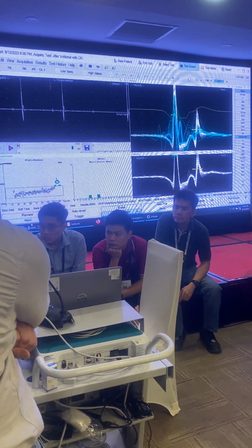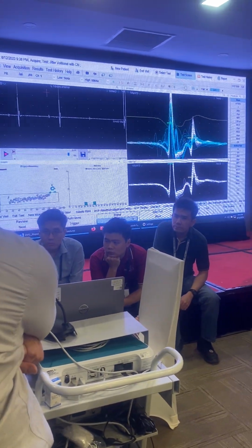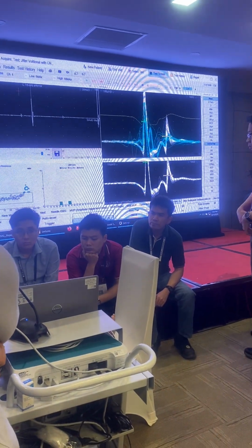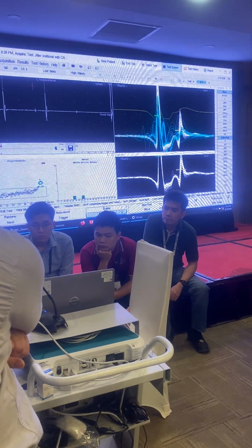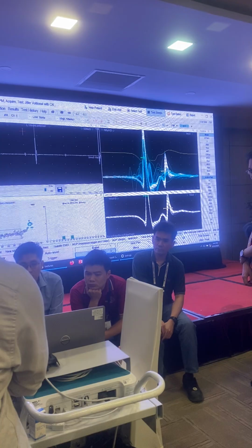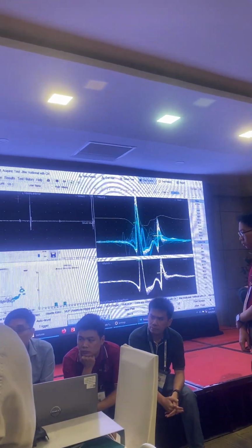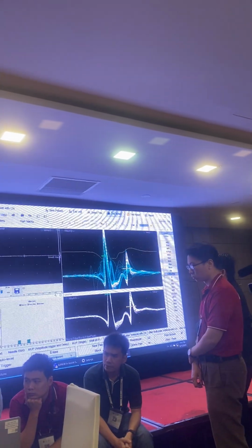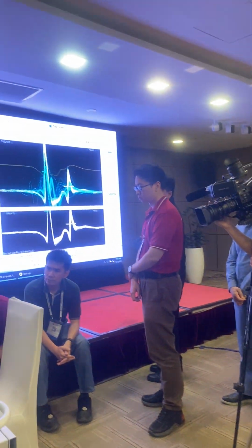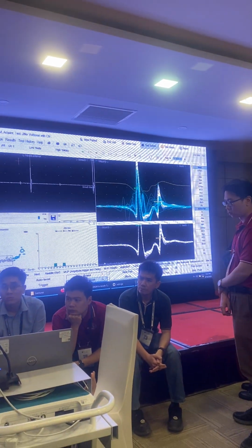So no problems. What I'm going to do is, this is my sequential interval plot. I always focus on this one. So initially there were some things that were not nice. I just say, okay, this is where I started getting good data, and up to this portion, that was good. Okay. So selecting data is important. In old days, we would take one waveform, keep it, reject it, then the second, and the third. This is far more important, much more easy.